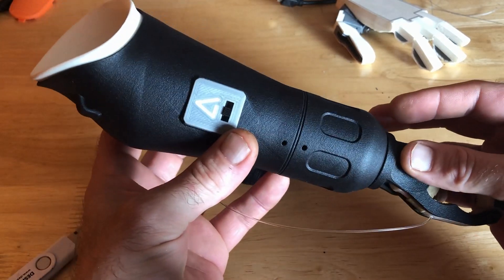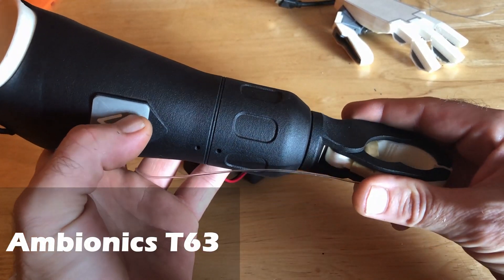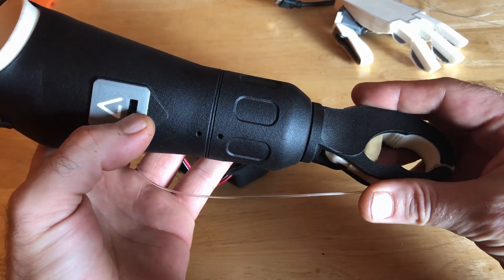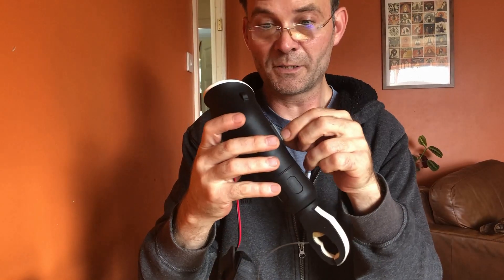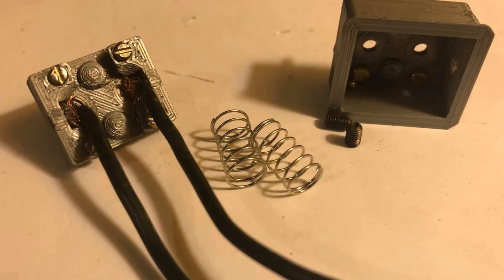Welcome everyone. Just a quick insight as to what I've been doing today. One of the things I've been working on for Sol is a switch for his prosthesis. In the original version of Sol's arm, we had an actual momentary switch.